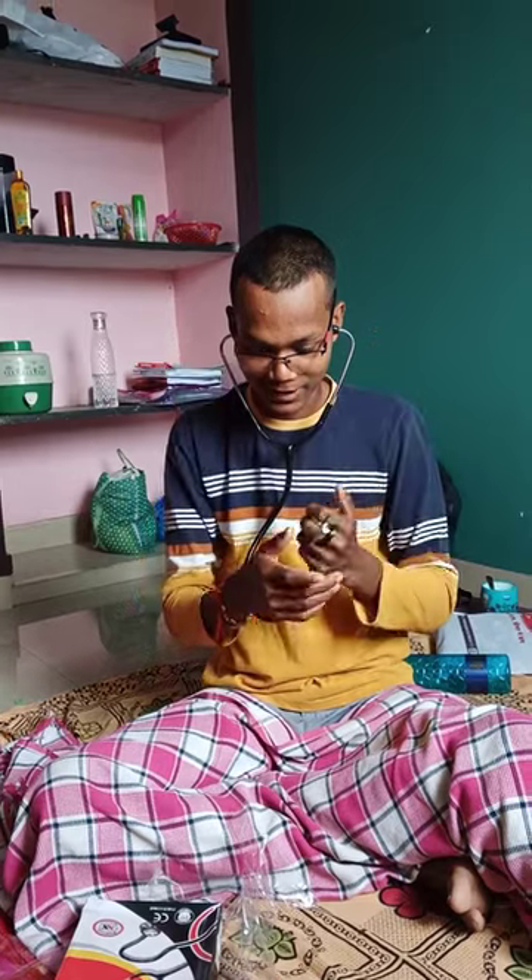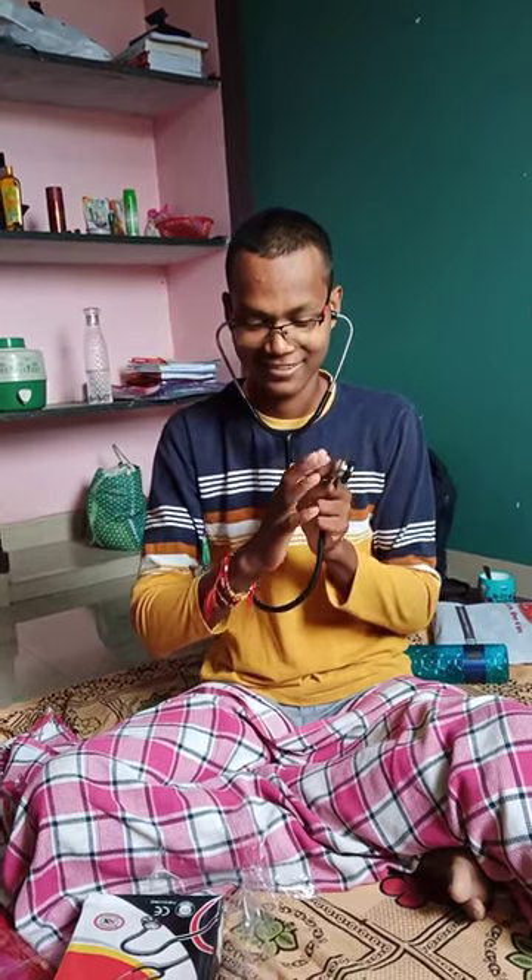So guys, let's check our own videos and see how it is going to come. Alright guys, let's see how it is going to come.